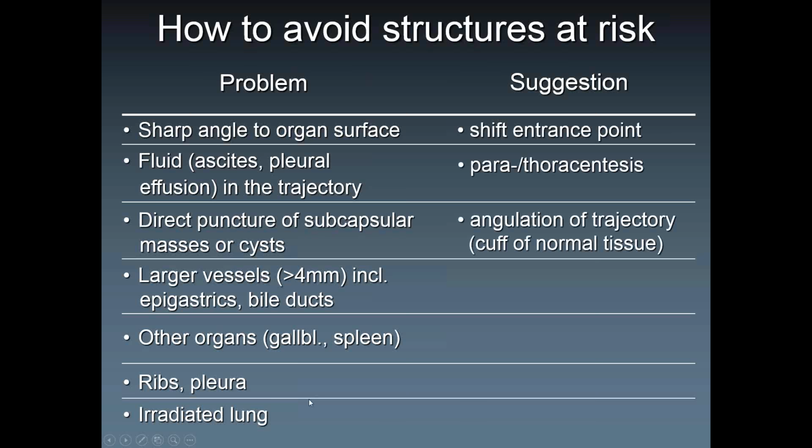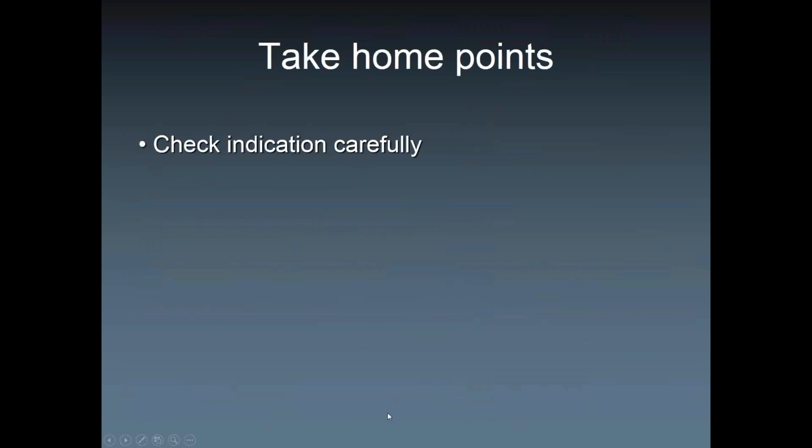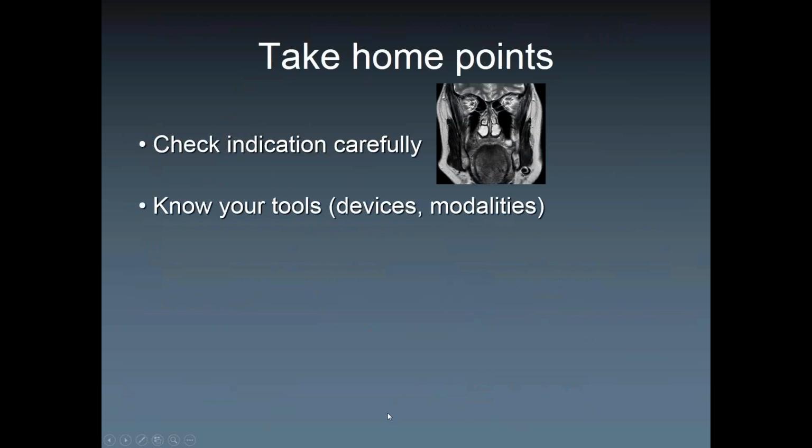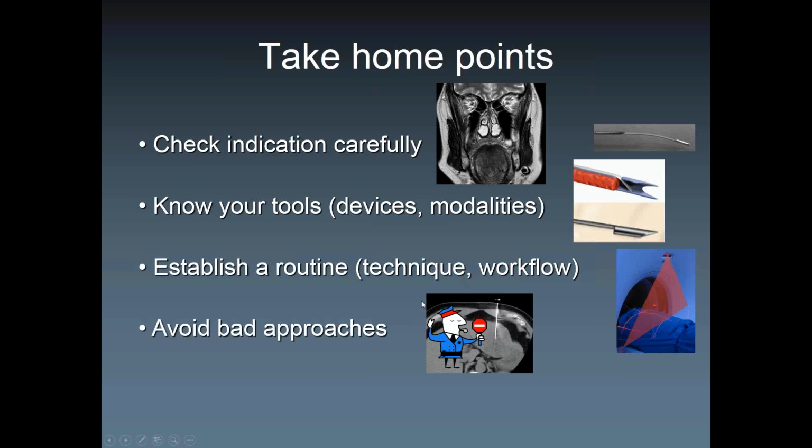So here's a list of things that you can look up in the recorded talk. I'm not going to read through all these again because we discussed all that, what to do in what kind of scenarios. These are some tips and tricks that can help you get by some problems. So again, make sure you get the indication right, know your tools and devices, know the techniques, have a workflow that helps the patient. Remember, just clean the skin first and then let the lidocaine work while you set up the device and all that. Then make sure you don't do any things that are up for malpractice problems. So always work in favor of the patient and check your results. Sometimes if you have negative results, it's up to us to call the clinicians and tell them what we can do better next time, what we cannot do, just so they have some guidance on what the next step would be.